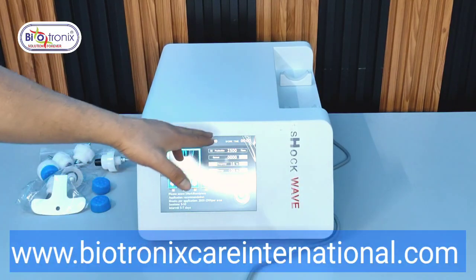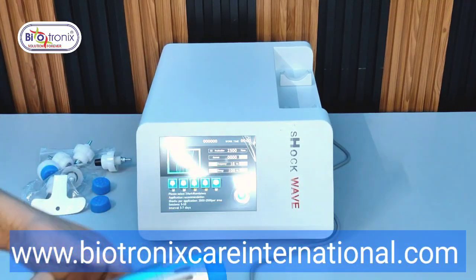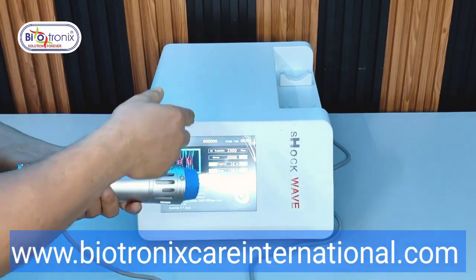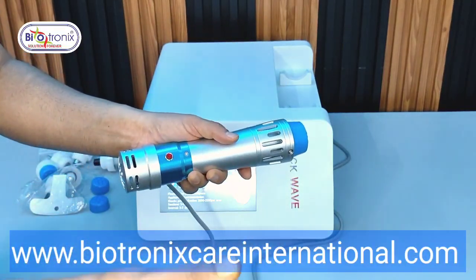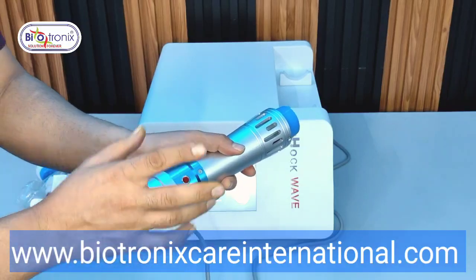Recommendations are there, and as soon as I start, it will keep on counting, and once the treatment reaches 2500, it will automatically stop. And if I want to stop in between, if the patient feels discomfort or the applicator may move here and there, then you can pause it from here also.